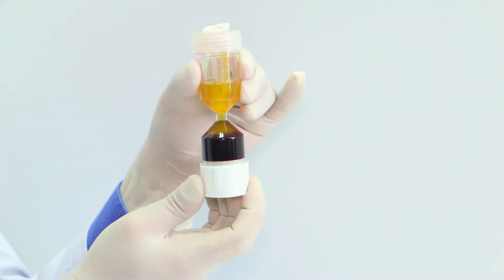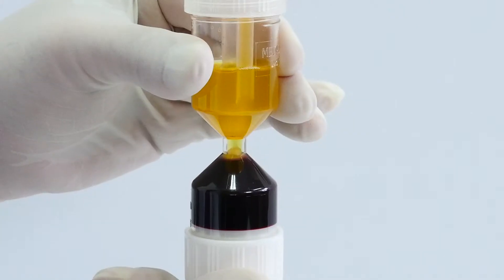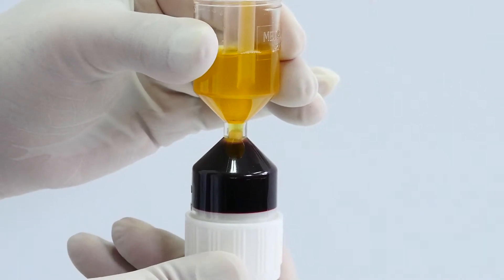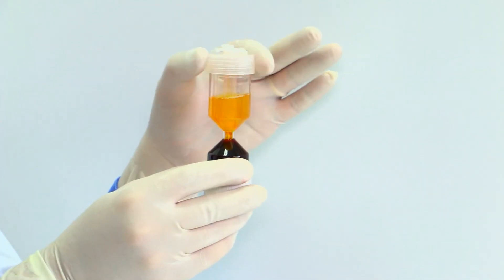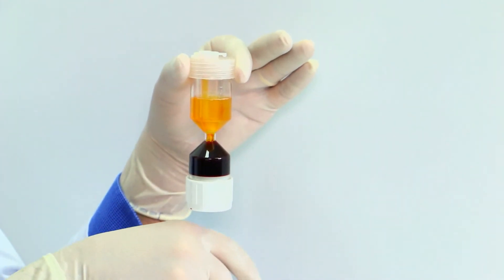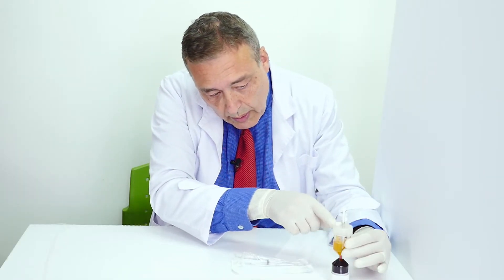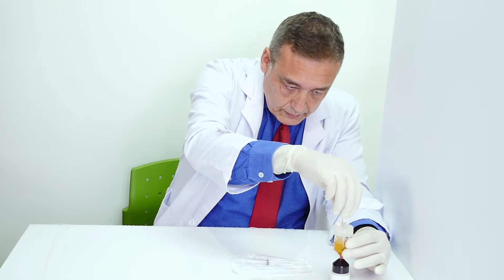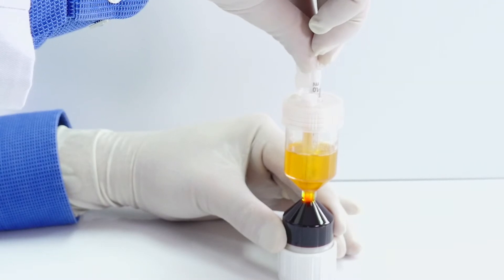You simply twist the bottom and you are going to see the buffy coat coming up very gently. Once the buffy coat raises the upper neck exactly here, you just need to twist the upper chamber. And that way you are going to be ready to aspirate only the buffy coat. So you just insert a 1 ml syringe in the middle shaft and then you will gently aspirate the buffy coat.